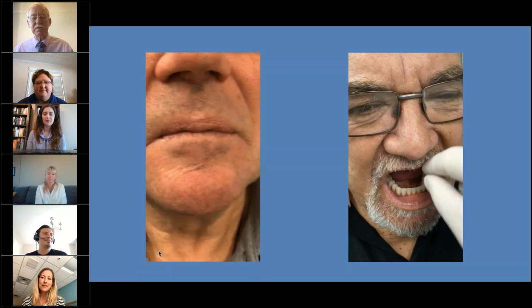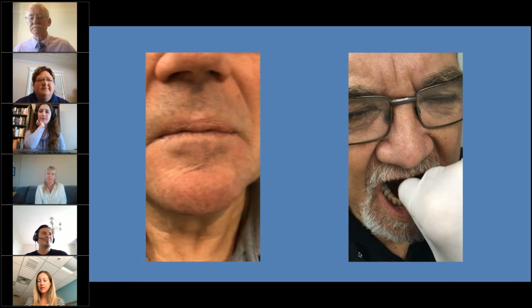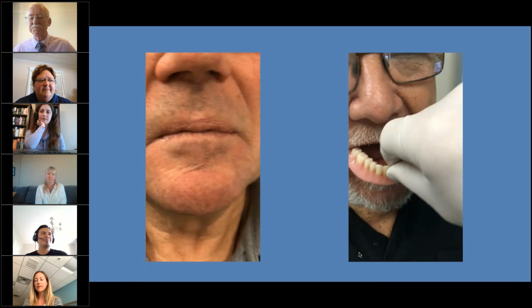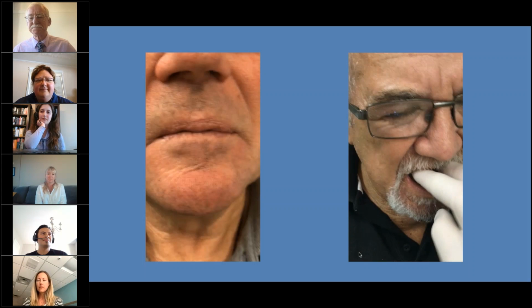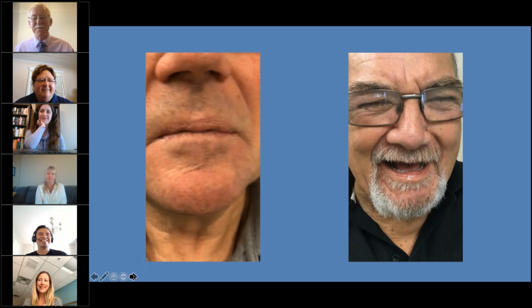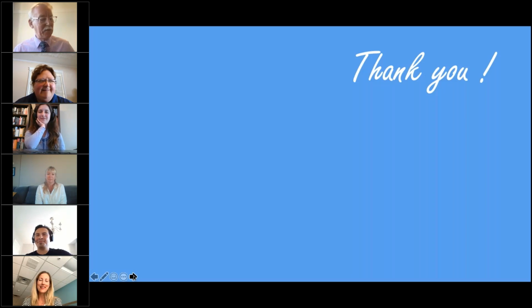and that patient has got a very, very atrophic ridge. I don't know what it's like in Canada, but most of our patients have got atrophic ridges, lower ridges. Brilliant. Yep, pulling my beard. So yes, you can get suction using that Dr. Abe's technique. So we've gone a wee bit over our 45 minutes, I think.